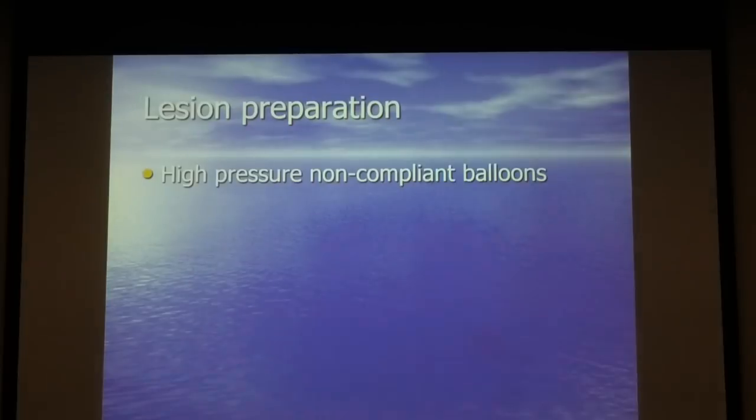What can we do with lesion preparation? We usually use high-pressure non-compliant balloons. It doesn't mean that you cannot use compliant or semi-compliant balloons, but it's preferable to use non-compliant balloons because of the angulation and because of the fibrosis and these resistant lesions in general.